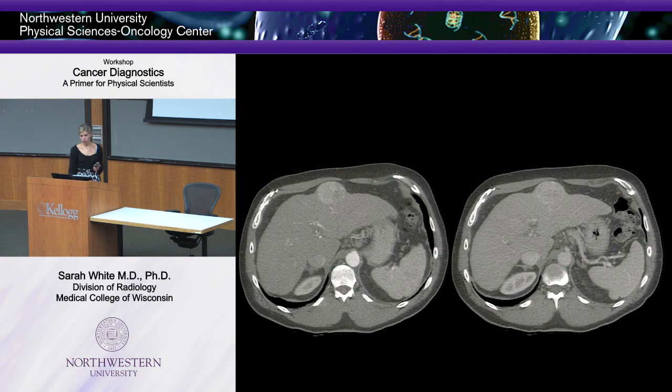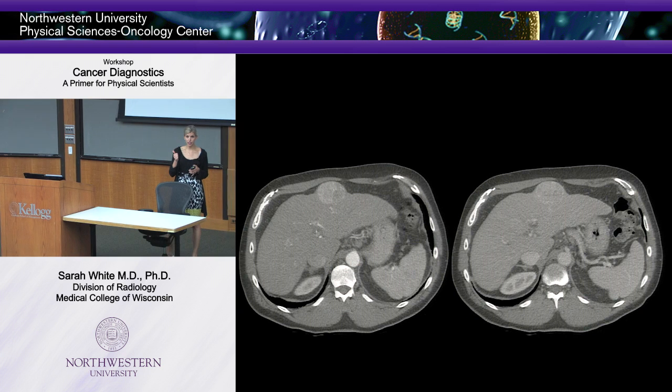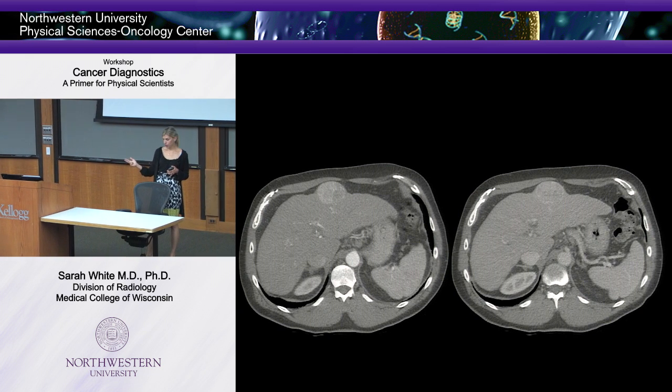So as imagers, can we make a diagnosis without doing a biopsy? Okay, is there any way that we can just say, this is what it is, I don't need to stick a needle in it? Well, for HCC, hepatocellular carcinoma, primary liver cancer, we can. Okay, this is I think one of the only cancers we can say, yep, 100%, I know what this is. We use tumor markers, alpha-fetoprotein, which is made by these tumors. If that's elevated in a cirrhotic with typical imaging characteristics, it's liver cancer, period. And that's what we did with this guy.